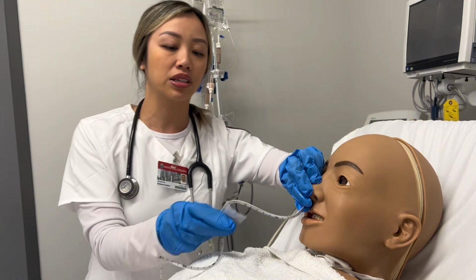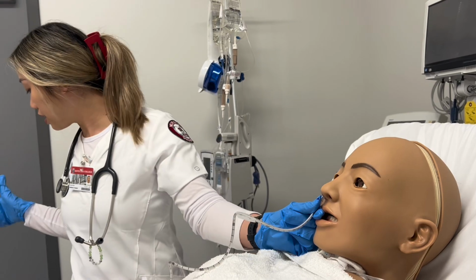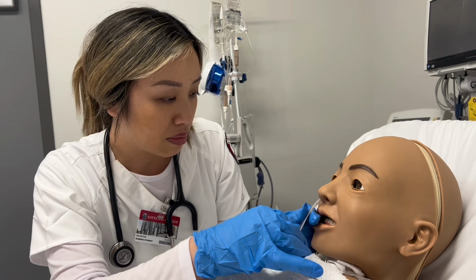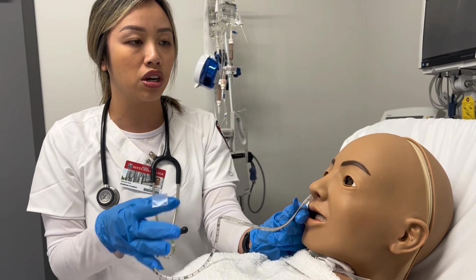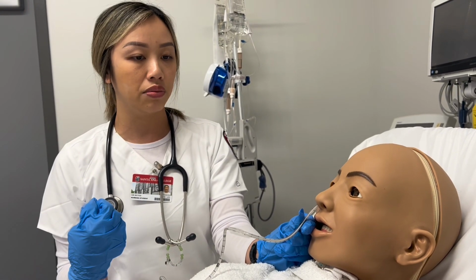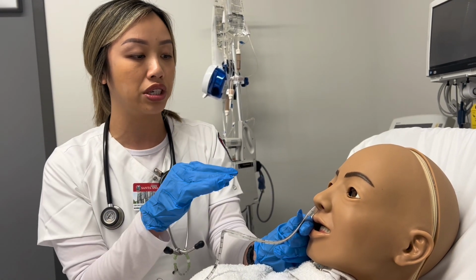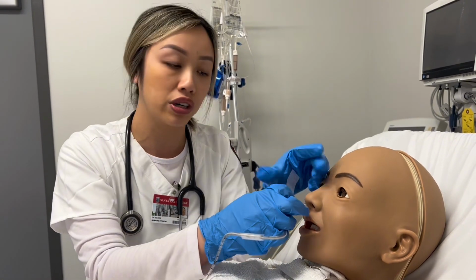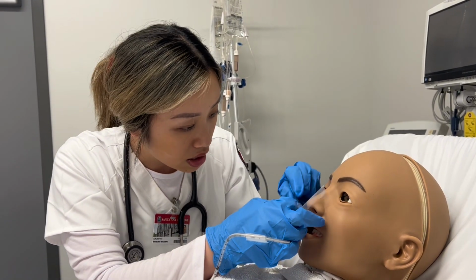But in real life, I would go ahead and go to the 50 marker. Okay, so then now I would go ahead and secure my tube, making sure that I don't see any type of respiratory distress in my patient, making sure that we're not cyanotic. If my patient was cyanotic in any way, I'm gonna take this tube out. If I notice any type of gasping for air, I'm also gonna take this tube out. But right now my patient seems to be tolerating the tube well. So I'm gonna go ahead and secure it for now. So we're gonna go ahead and secure it with a stat lock.